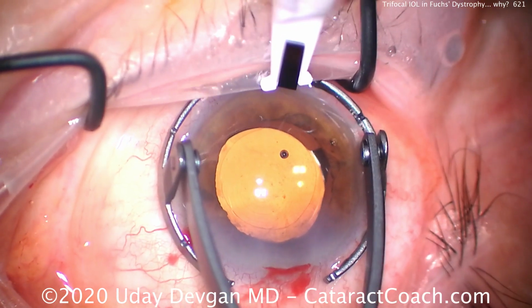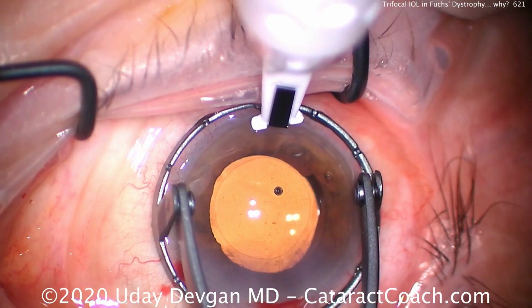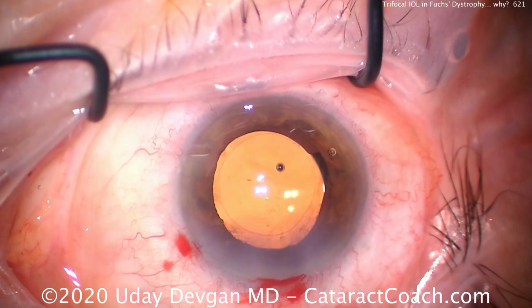The last bit of the surgery here is just doing a very small limbal relaxing incision. That paired with the phaco incision will decrease that steep astigmatism that's at the 90-degree meridian.